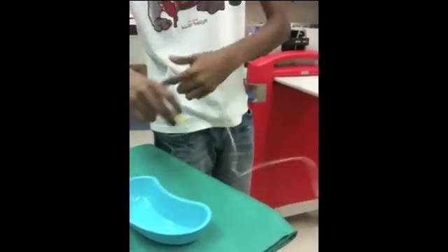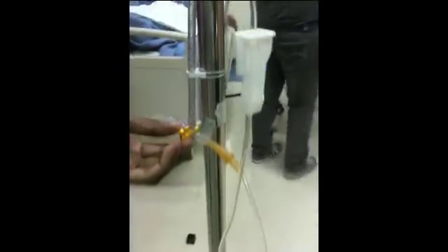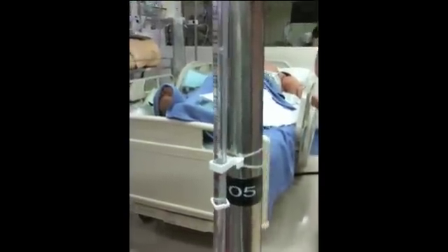Now I'm going to prime my set. First, I'm going to prime to the manometer. So let me turn this on a bit — priming from the back like this. We're going to release the clamp until it reaches 15 to 20. Then I will turn this one over here and start priming. Once I've finished priming, I'll clamp — and this is done. We do an alcohol swab, and now I'll bring it to the patient.